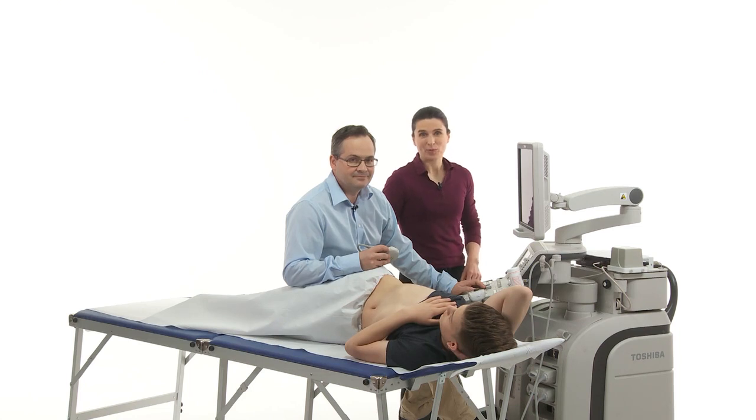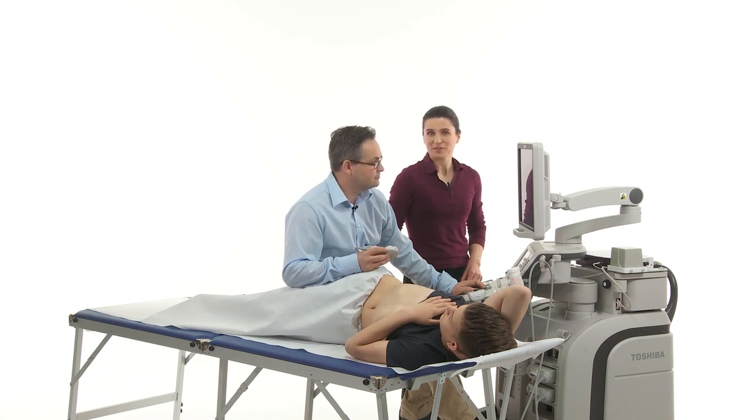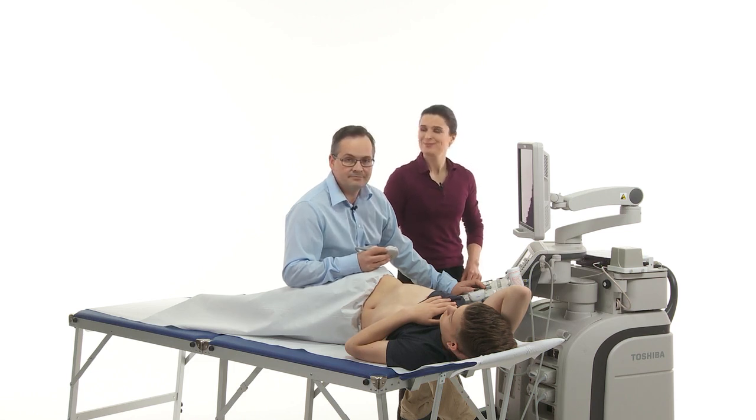Are you ready to perform an ultrasound scan of the gallbladder? The gallbladder can be a rather tricky organ to find sometimes, but Christian will give us some tips and tricks to get a good view of the gallbladder.